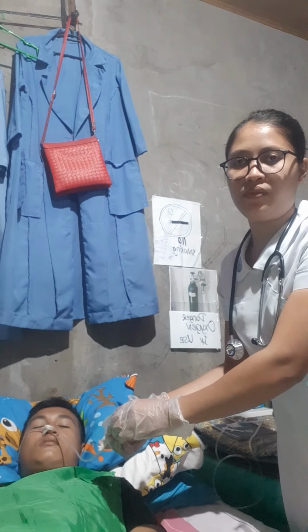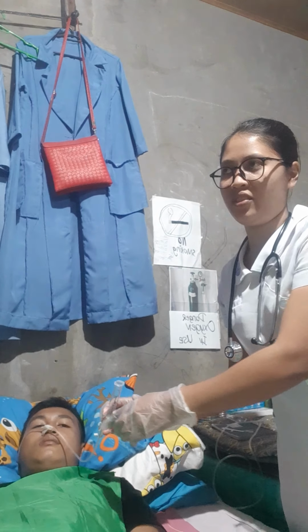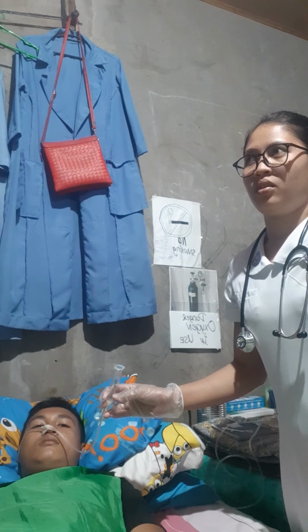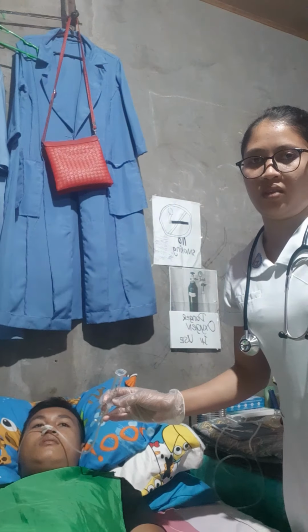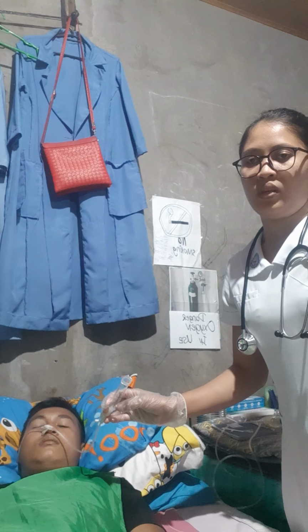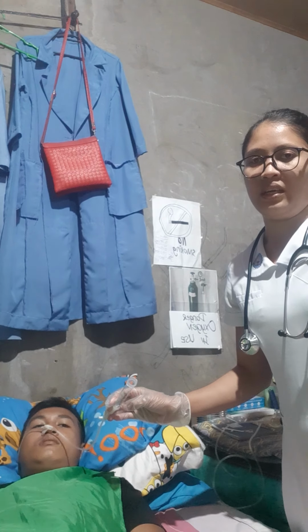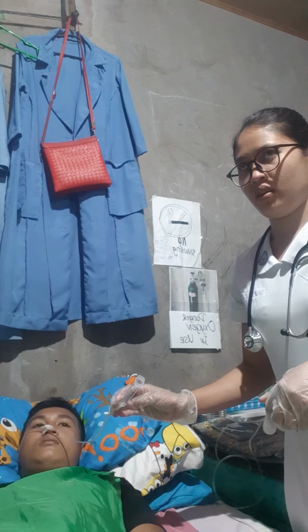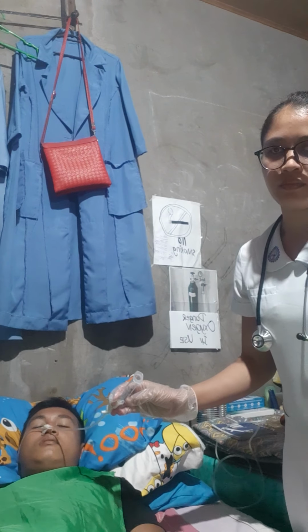If the feeding is already flowing at the prescribed rate, it should be the physician's prescribed rate, then we need to lower the syringe or adjust the flow if needed, so that it will not cause any harm to the client.